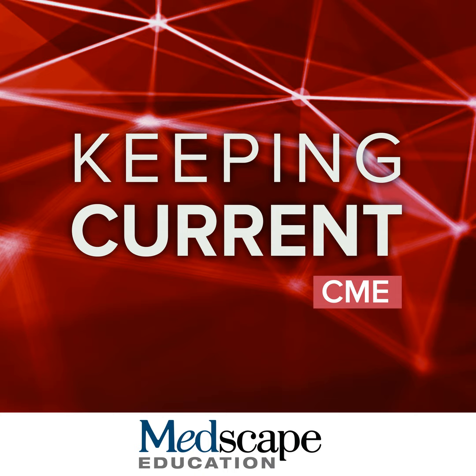And just to put this out there, the reason that we thought of this in the first place was somebody can get injected with contrast, or gadoxetate, in the waiting room, wait 20 minutes, then get scanned. And so you don't have the problem of potential repeated sequences. If you have to repeat it, you can if there's motion, and you're not relying on dynamic contrast enhancement or hooking people up to a power injector.